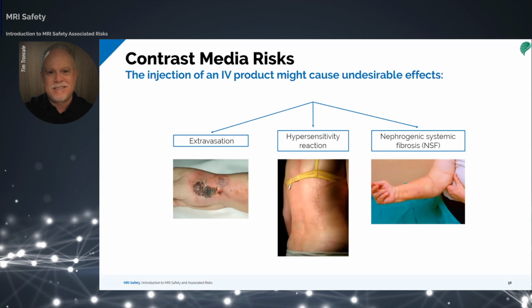We will also look at the other possible risk that is still being researched and studied, which is, as I mentioned, the retention of contrast in the brain. We will look at these again individually.